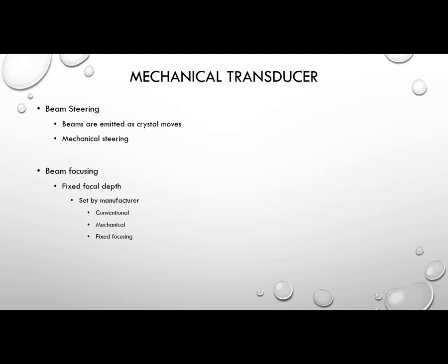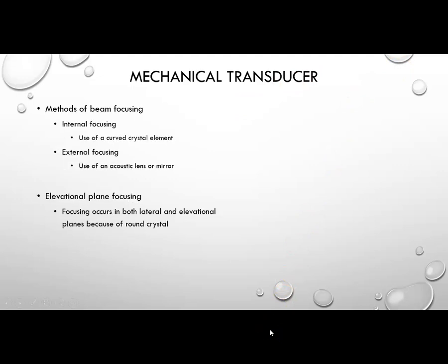Focusing is fixed with these. The manufacturer will set it where the focus should be. It can't be changed. So this is what we call conventional, mechanical, or fixed focusing. We can't adjust it. It's set by the manufacturer, and it doesn't change. So in those respects, it's fairly easy.